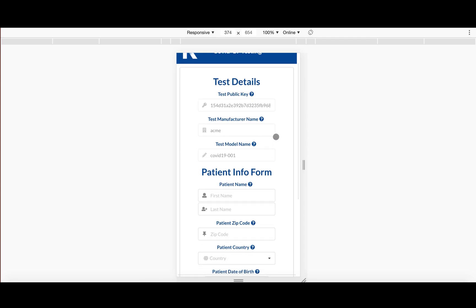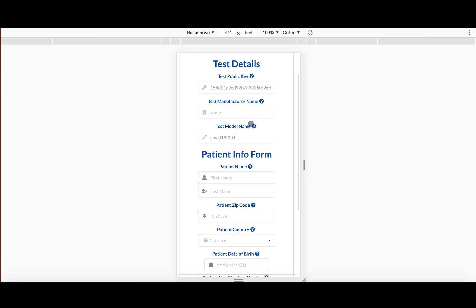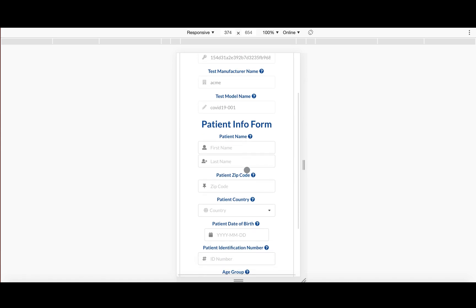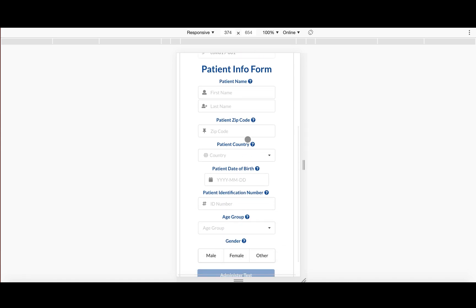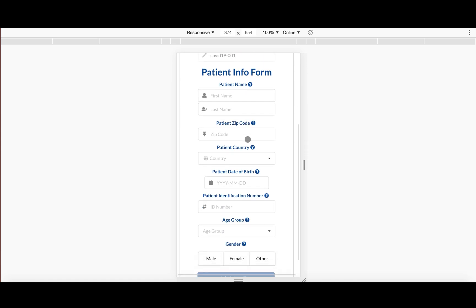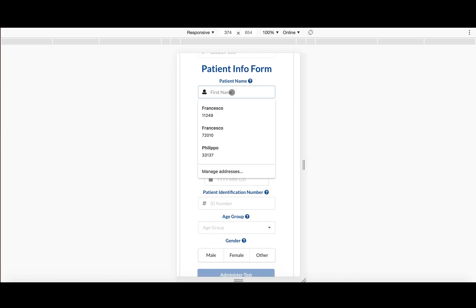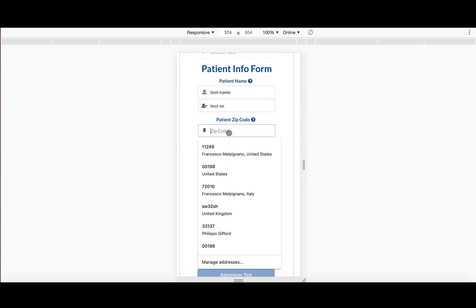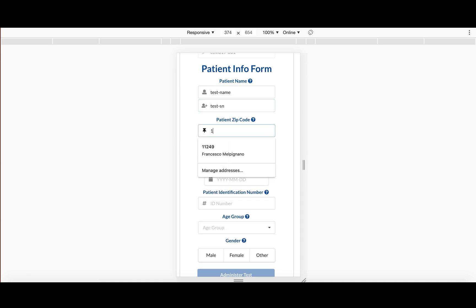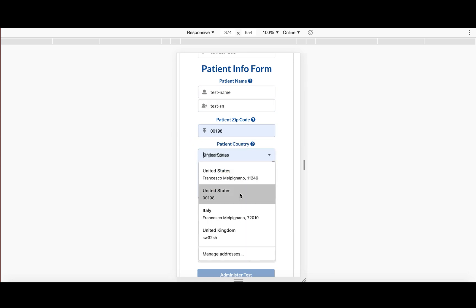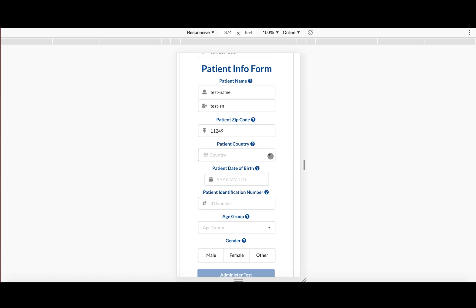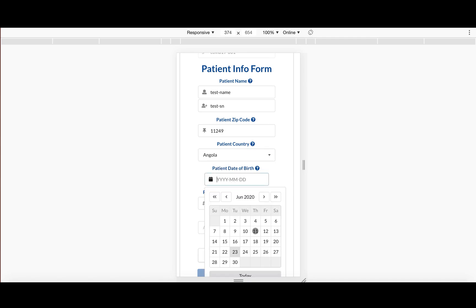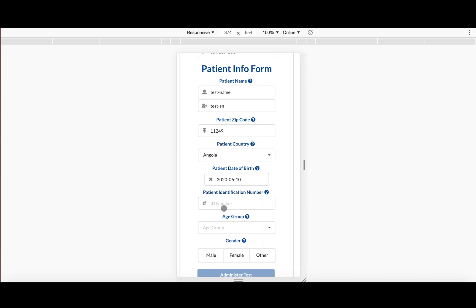So then you just simply fill out this form. Test name, tester name. Let's say he lives in Brooklyn somewhere. Sorry, that's just my autofill there. Let's just click our random country and birthday.